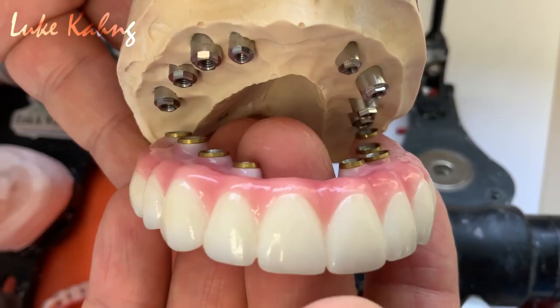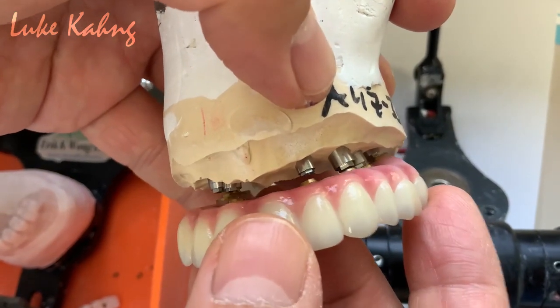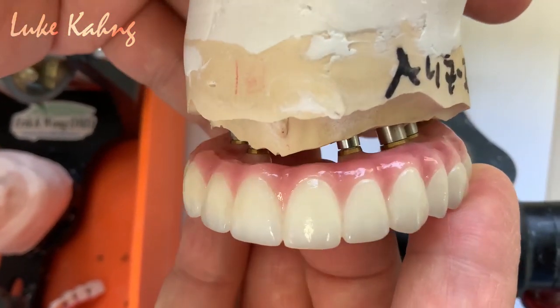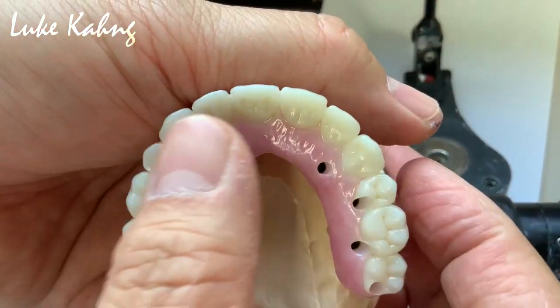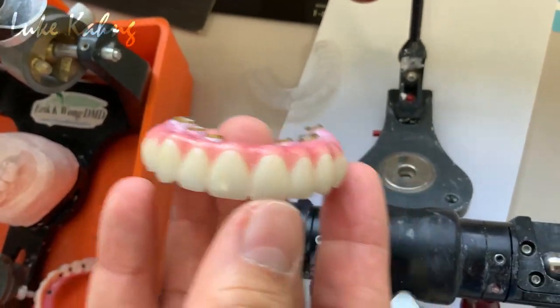It's another nice case with 8 implant. So it was a little tough matching the tie base all the way down, but we made it. Okay. It's lifelike restorations, all monolithic here. Almost minimum.